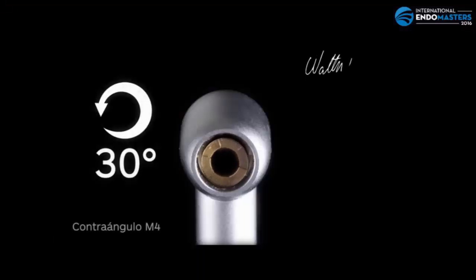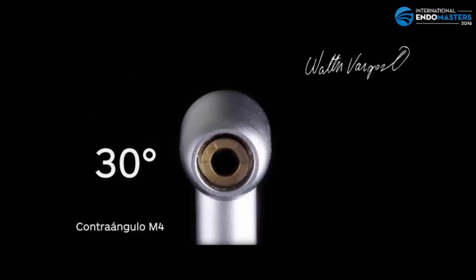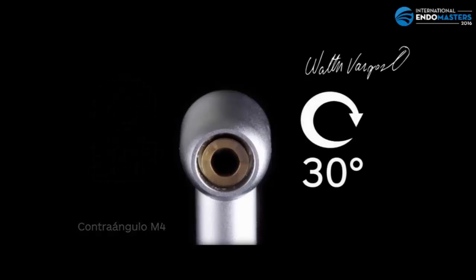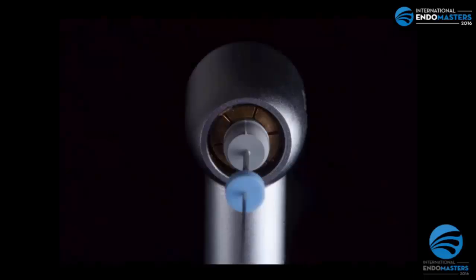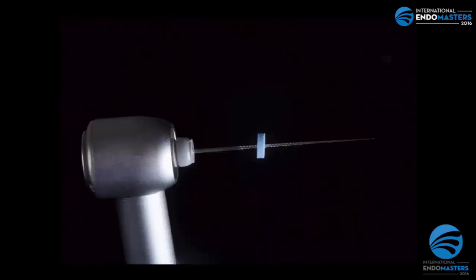The M4 contra-angle moves 30 degrees to the right and 30 degrees to the left in really fast motion, close to 4,000 RPMs. You can see how the contra-angle grasps the hand file.